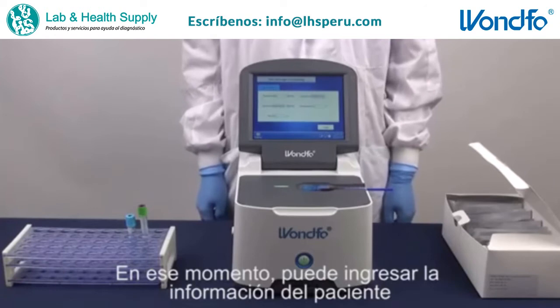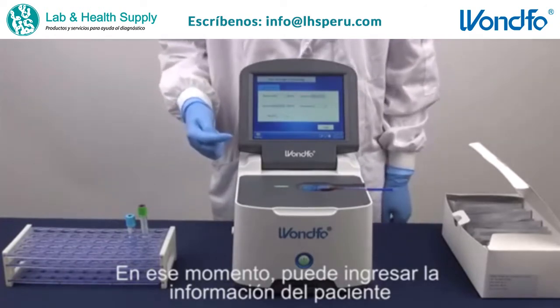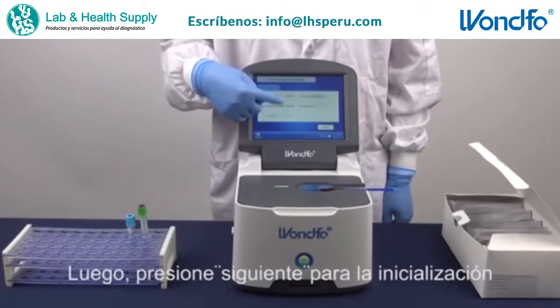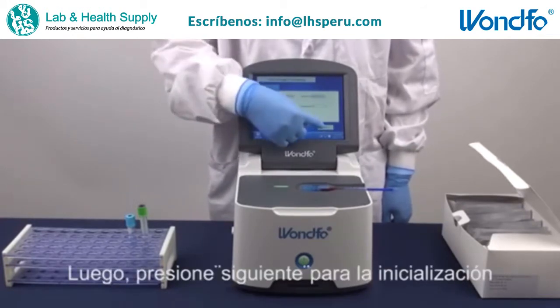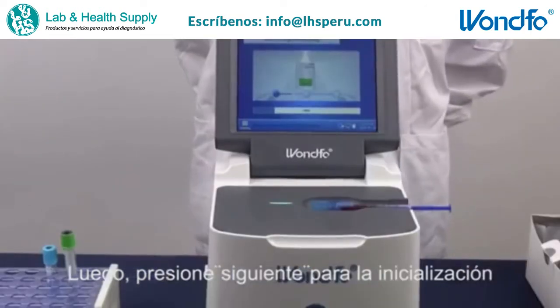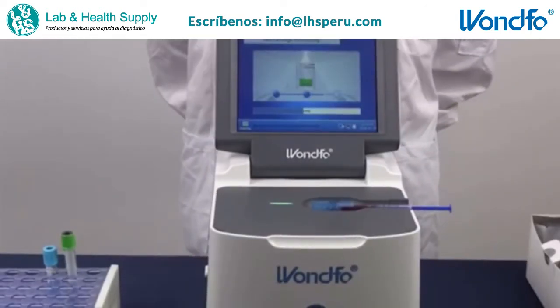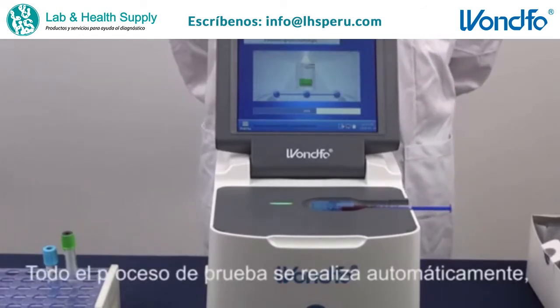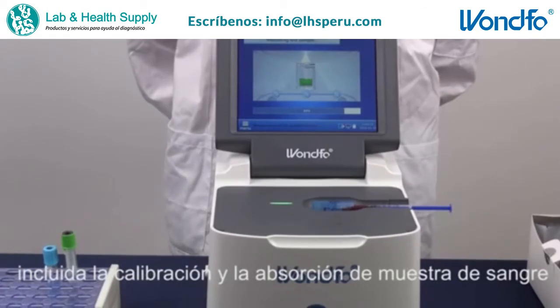Right now, you can enter the patient's information. Afterward, press Next to start initializing.